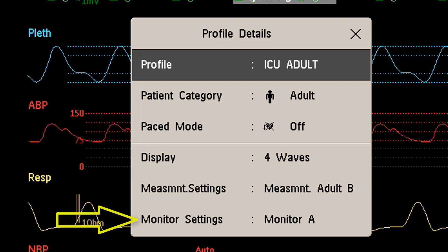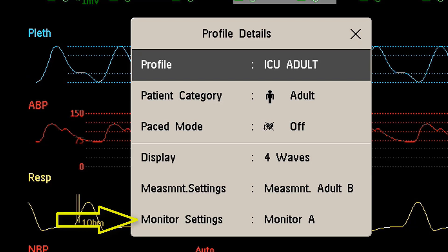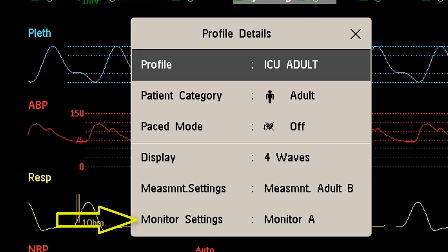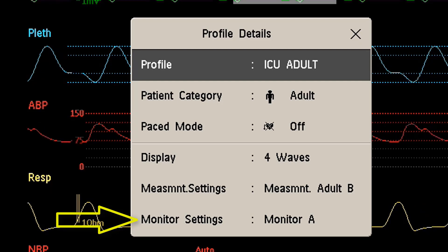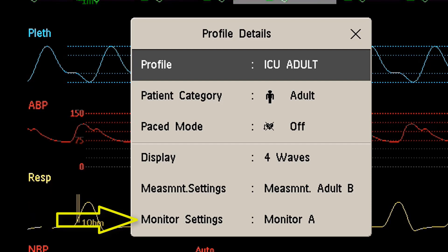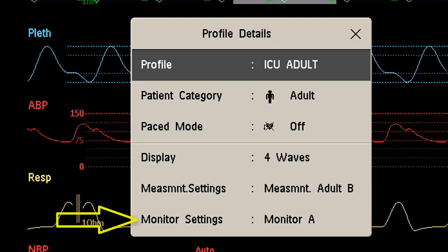The third category is monitor settings. These relate to the monitor as a whole — for example, the brightness of the display, the default alarm volume, the default QRS tone volume, the wave speed, the pulse source, and many other things.